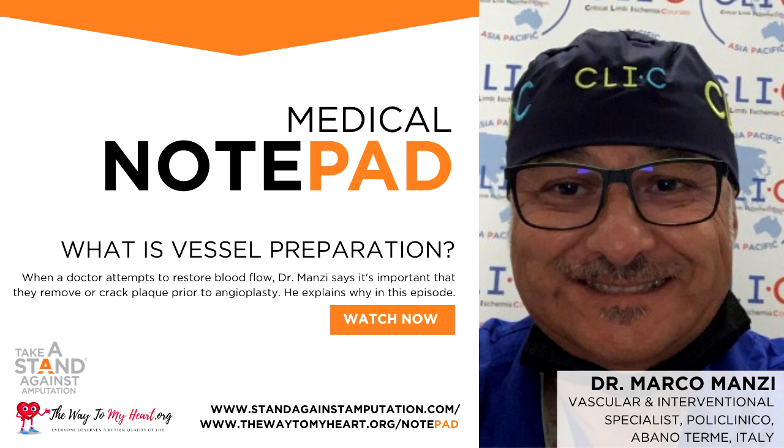Of course, we are speaking of endovascular revascularization. We can prepare the vessel for stenting, for angioplasty, for drug elution. So I mean the use of drug-eluting balloons, for example, but even for a simple angioplasty. What does it mean, prepare the vessel?